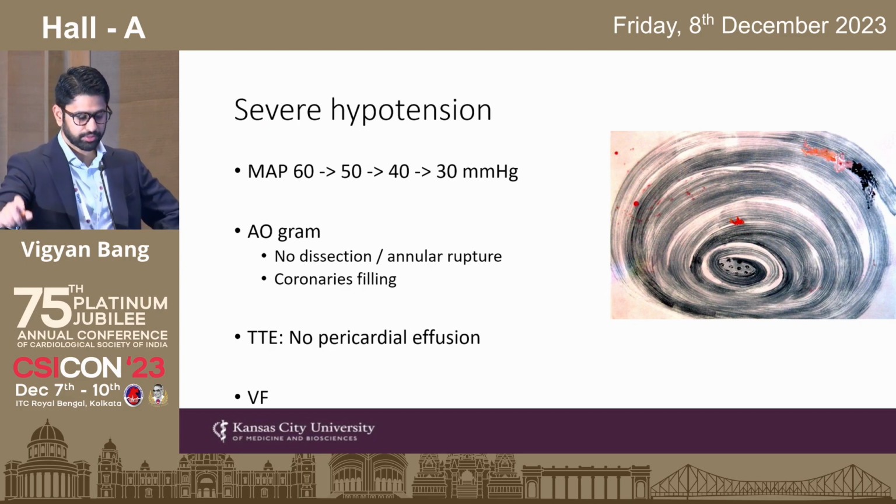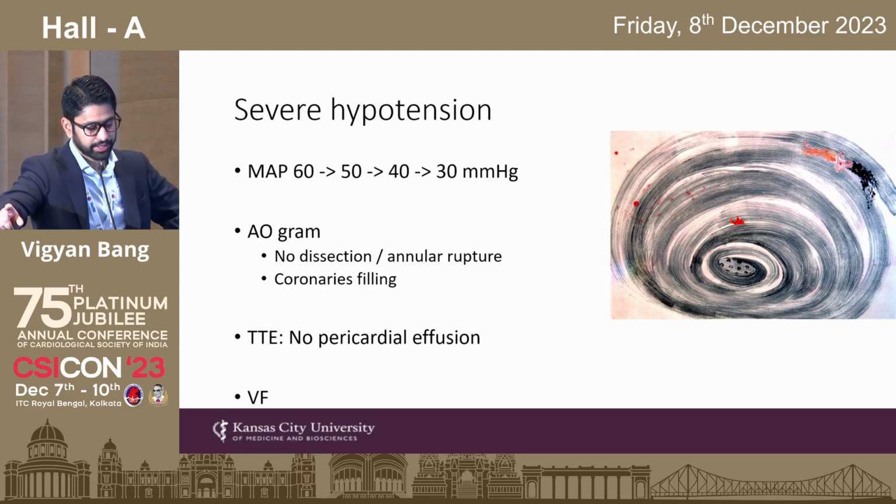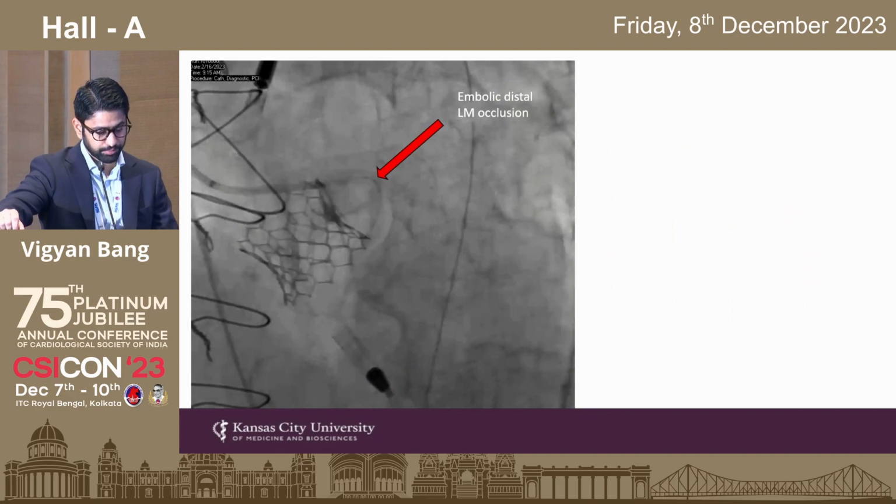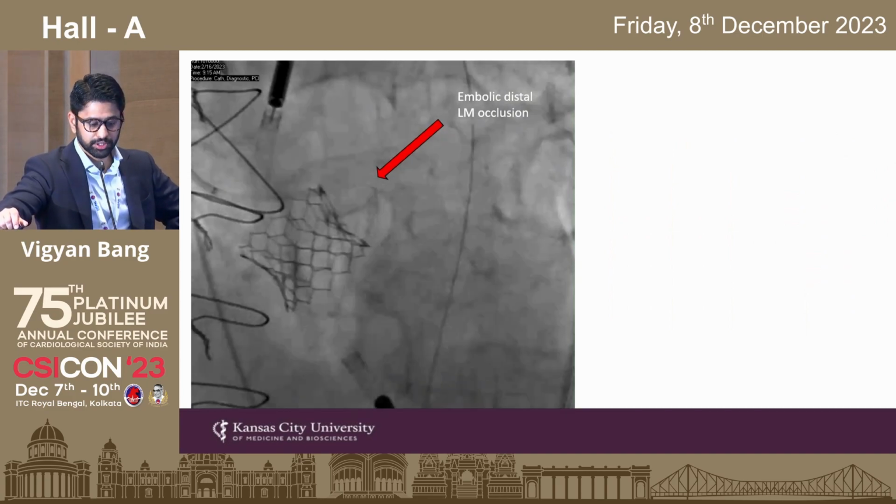And this is an important point. I'll come back to this in the next slide. But his coronaries on the aortogram were filling. His echo suggested no pericardial effusion, and shortly after that he went into VF. So he was shocked, CPR was started, and we put in an impeller to restore the hemodynamics.